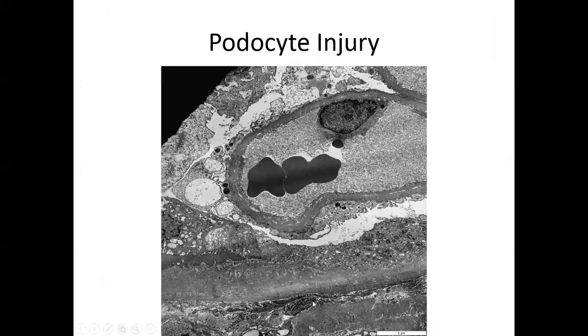Okay, here are just other pretty examples of podocyte injury. Here's a podocyte here that has these large cytoplasmic vacuoles. There's a lot of research now about autophagy in podocytes and how the podocyte should be extremely autophagic. It should completely be always turning over its cellular machinery because as we think about it, it's pretty much terminally differentiated. It's very hard to get a new podocyte. So they have a very high autophagic flux. Autophagic flux? Yeah, that's how you say that.